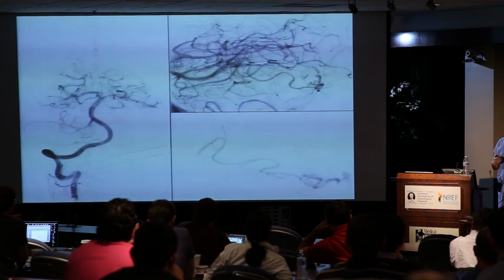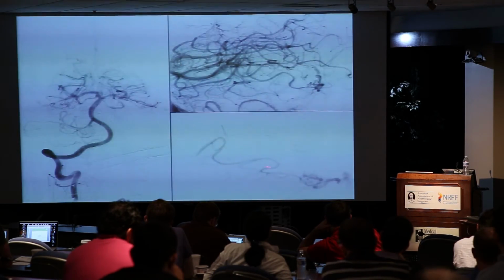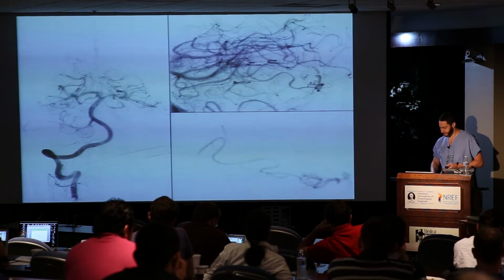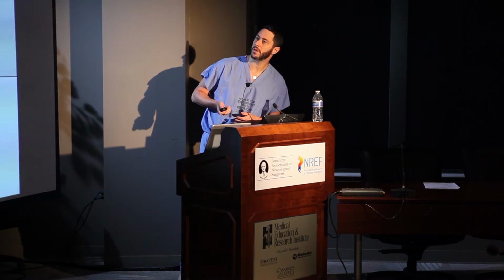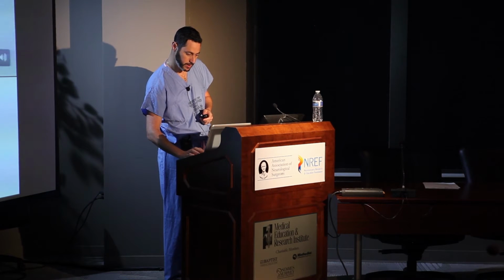And even in microangiography, you should try to look at primary and secondary arterial supply, all the things that we talked about before. Your eyes will go here and see this. And you're like, this is where I want to put my microcatheter. But this goes to the AVM too. And I'll show you a picture of that, or a movie of that in a second. There's one projection of that actually. This one's probably that.